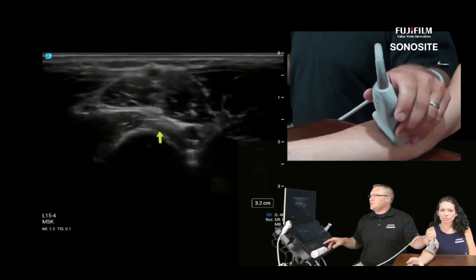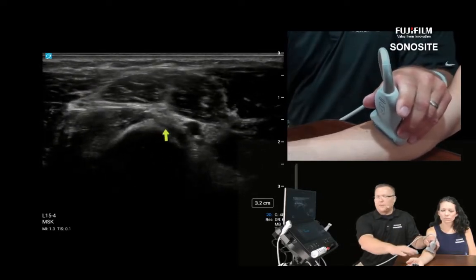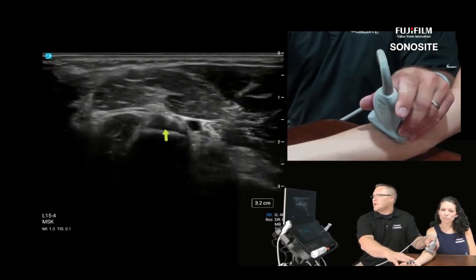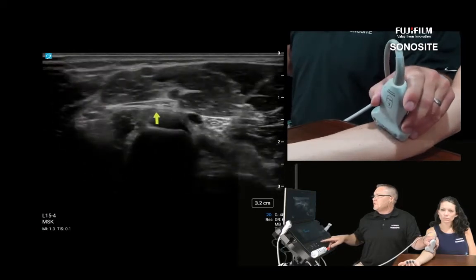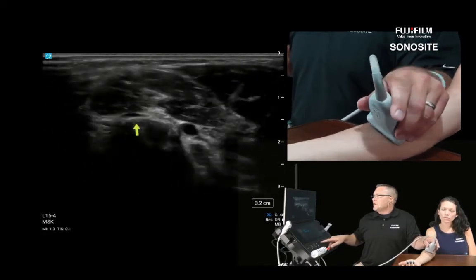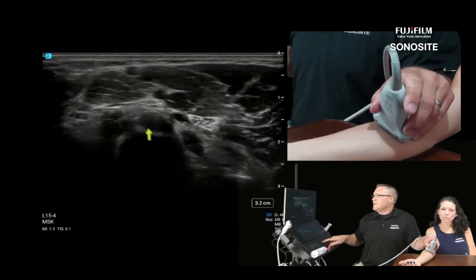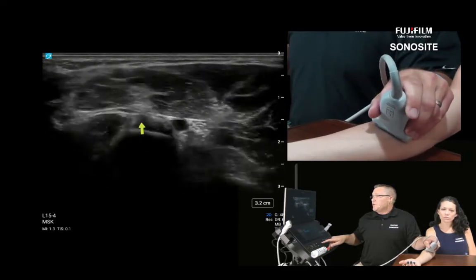If you're not confident you're seeing all these fibers, as Bill mentioned in the PowerPoint, I'm going to supinate, bringing that radial tuberosity much more anterior. So here we are with the distal biceps tendon very anterior now. I can get a very nice 90-degree cross section on it, where it's most important to see the breadth of the tendon and all of its fibers. From here, if you wanted to go long axis, you could.